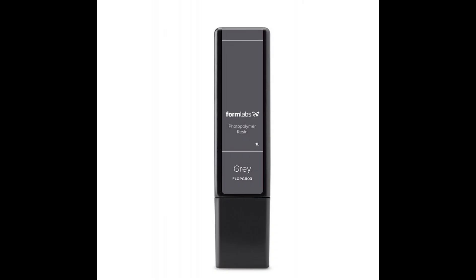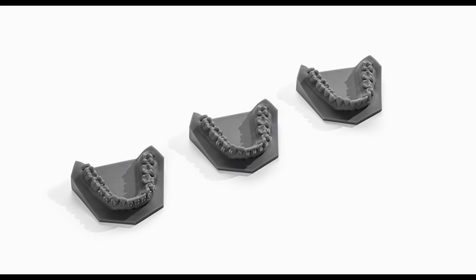Standard Gray Resin — the smooth matte finish of Standard Gray Resin shows details exceptionally well. It is ideal for a variety of dental applications including orthodontic, diagnostic, and educational models, as well as for vacuum forming aligners or other appliances. When used with a clear separator, Gray Resin can also be used to make retainers.